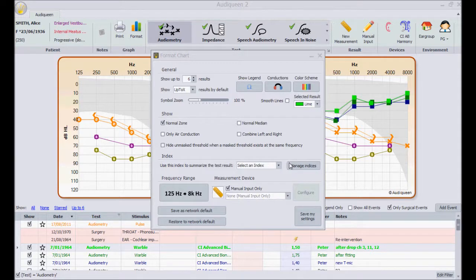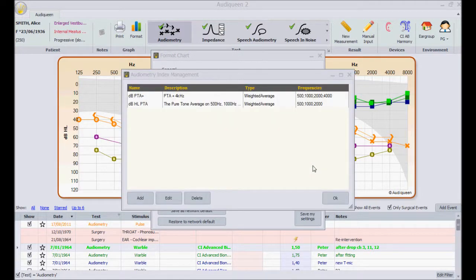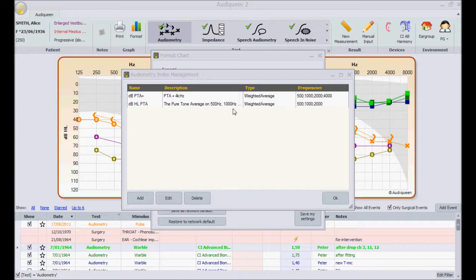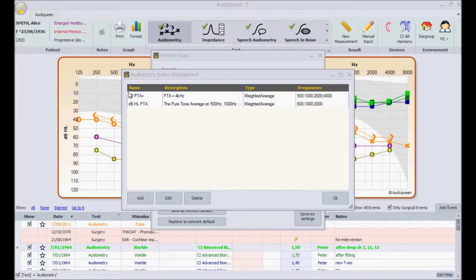Since I have administrator rights, I can manage the indexes here. I already have two indexes: one is the pure tone average or PTA. It calculates the averages of the thresholds at 500, 1000 and 2000 Hz. The extended PTA is the average of 500, 1000, 2000 and 4000 Hz.